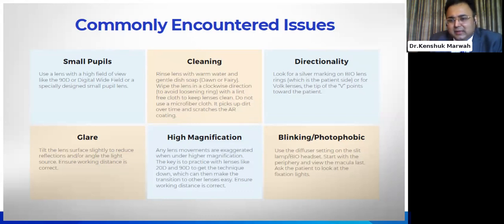The other thing is about the lenses, which I learned in residency. Our professor Dr. Shashank Patel was very particular on how we should take care of our lenses. He always says to rinse your lenses with warm water and gentle dish soap, whatever soap is available, and it should always be cleaned in a clockwise direction, with a lint-free cloth, so as to keep your lenses clean. Because sometimes dirt comes up on the lenses, always keep your lenses in a place where there is less dust.